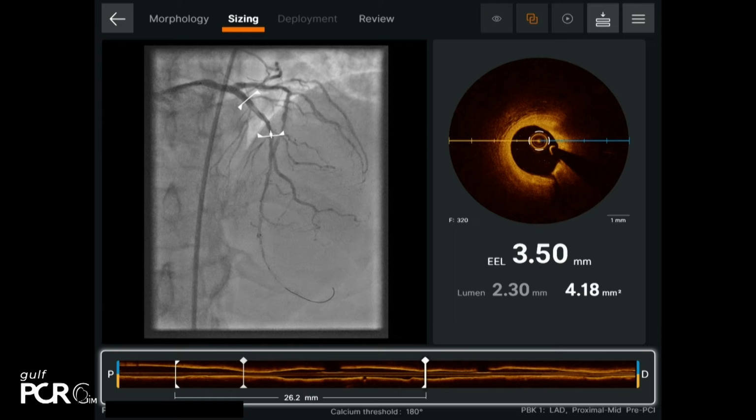Sure, we know with a calcified nodule, the balloon will not really move it away. We need to shape that calcium protruding in the lumen. So either we use orbital atherectomy or rotablation. And we felt, because sometimes rotablation, because of the wire bias, can really go beside the calcium nodule and may not shape it well unless you choose the size of the burr to the lumen well. We thought orbital atherectomy will definitely shape it. So because of that, we thought balloon-based lesion modification will not be as good as atherectomy.